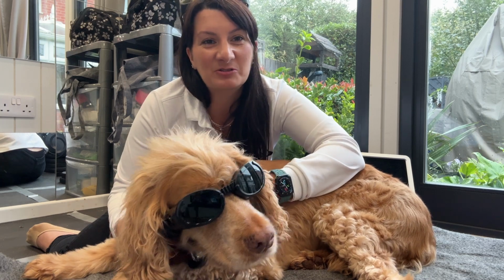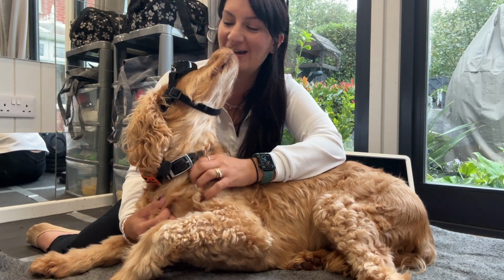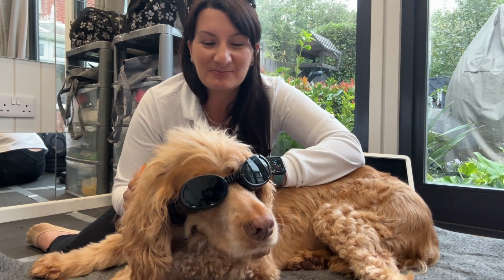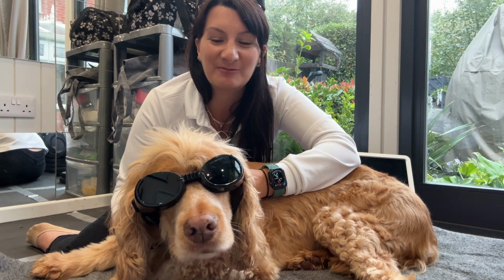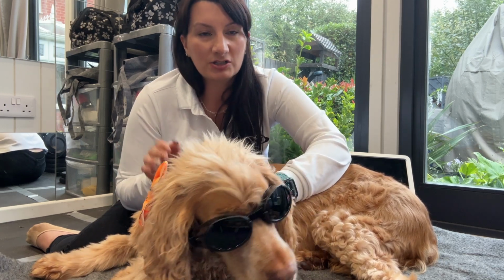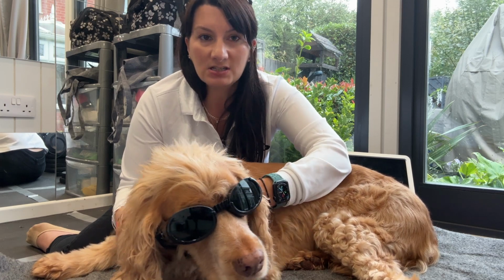Today I thought we would talk about how to optimize our treatment and get the most out of our laser devices. As you can see, I've got my willing participant who's ready to go for his treatment, as he absolutely loves it.